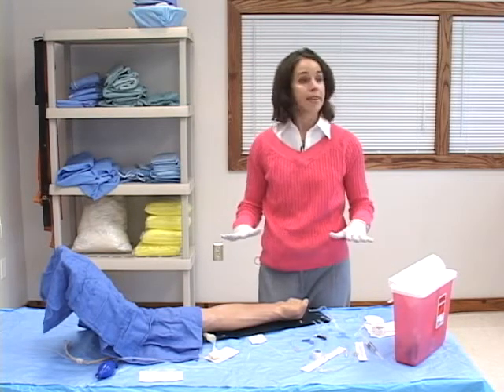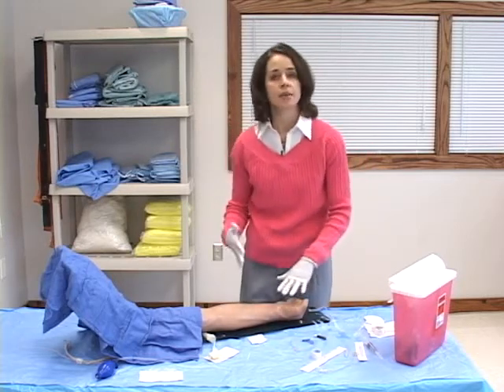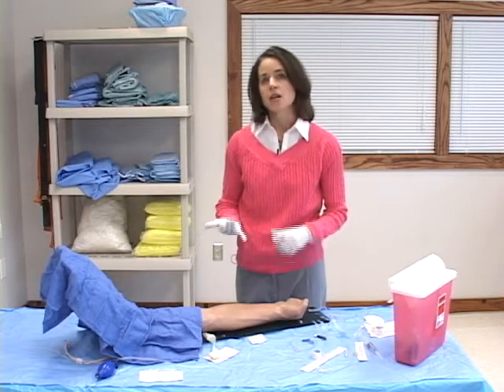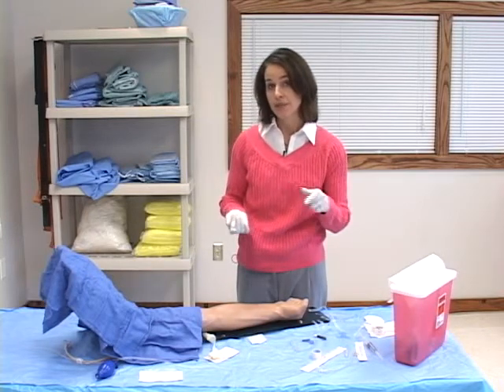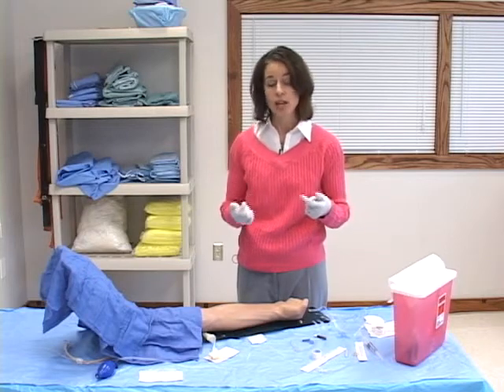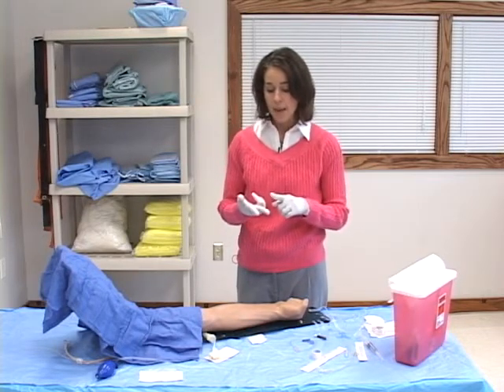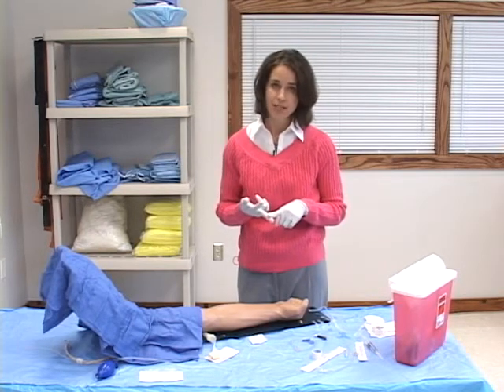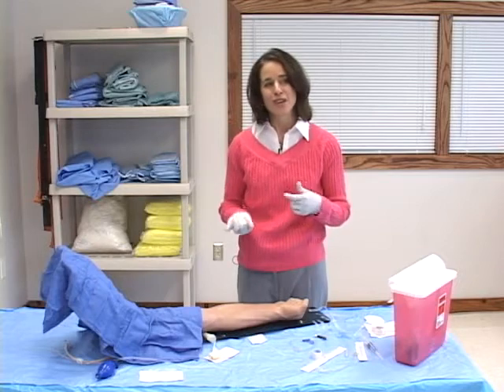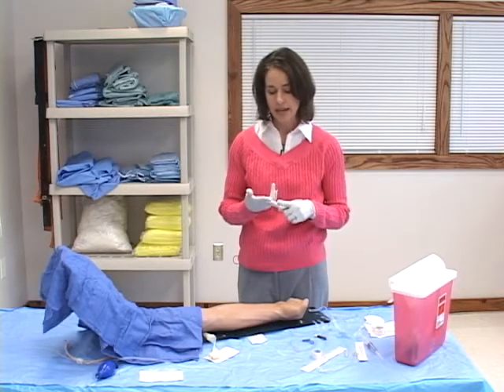So I have all my things ready, and then I'm going to look at the child, and you have to remember with the child some of the anatomy is a little bit different. So for a baby or a neonate, you may want to consider looking at some scalp veins. They're a little bit easier to visualize. You don't have the thicker sub-Q fat that you're dealing with for the scalp veins. You may consider in a non-ambulatory child using the saphenous vein. You don't want to use it in a child who's walking, because that would be difficult to keep them in bed the entire hospital stay.